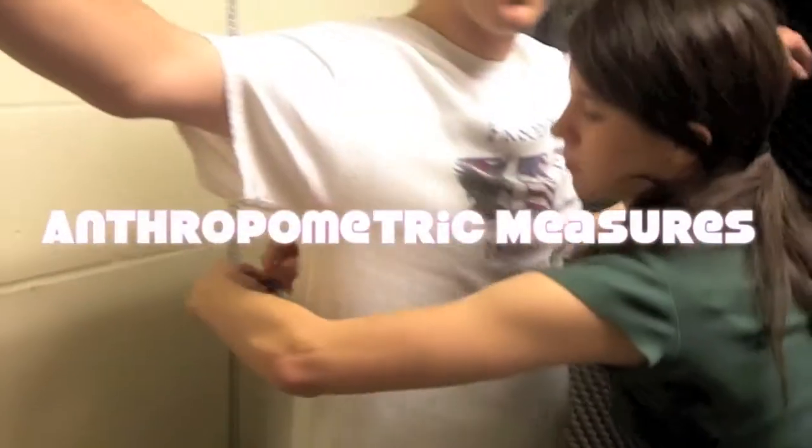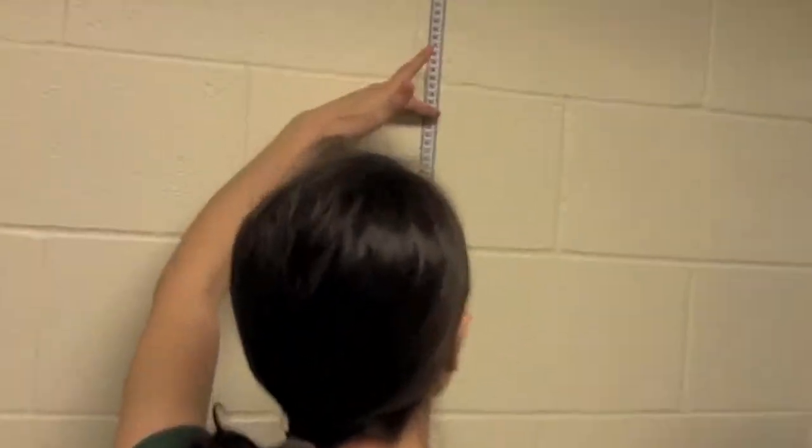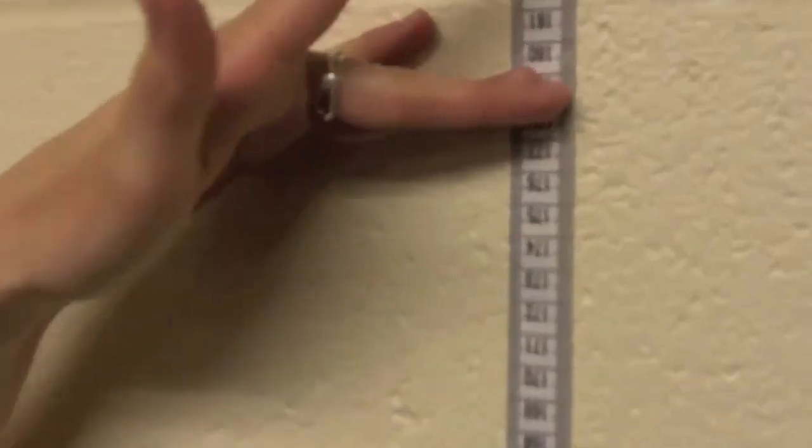Anthropometric measures: How to measure height. Ask the participant to remove their socks and shoes. Instruct them to stand straight against the wall. Record height as marked on the measuring tape. A stadiometer can also be used to measure the participant's height.